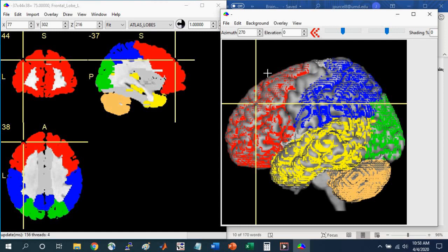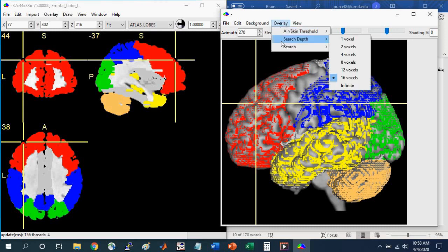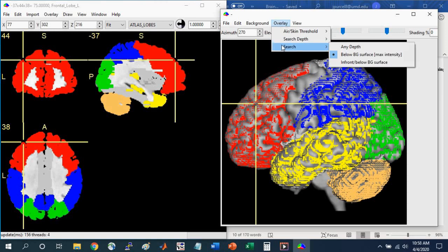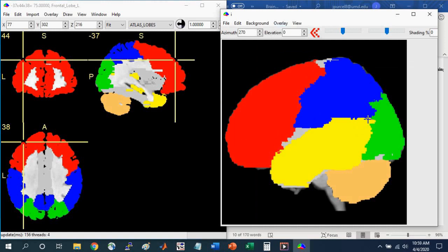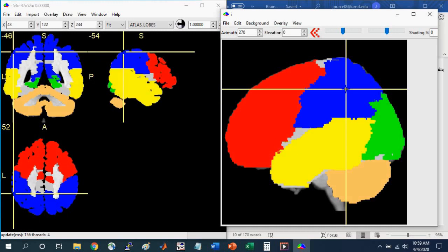If you want to make it a little clearer on this rendered view, you can go to Overlay, Search, Any Depth. Here it will just fill in these colors at any depth through the brain, whereas previously it was searching only 16 millimeters deep inside of the brain. This left profile view of a 3D brain is something you might see in textbooks and it might help you to understand how these structures in the slice view match onto the 3D brain. If I left click here in the parietal, you can see how this point on the surface matches at this point on the slices.